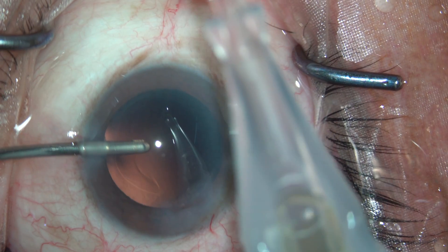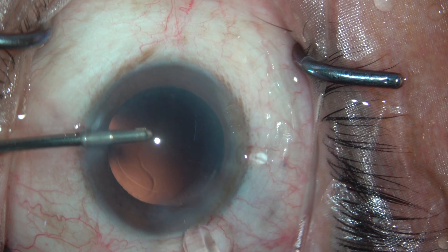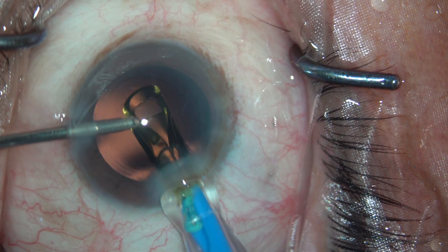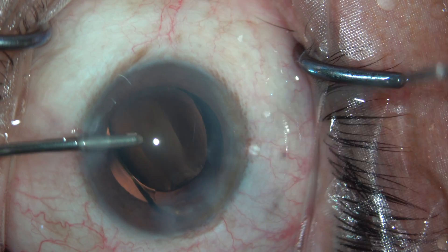The lens that I'm going to implant is a pre-loaded Alcon Clareon lens. It's a wonderful monofocal lens — very smooth delivery, goes inside very comfortably.